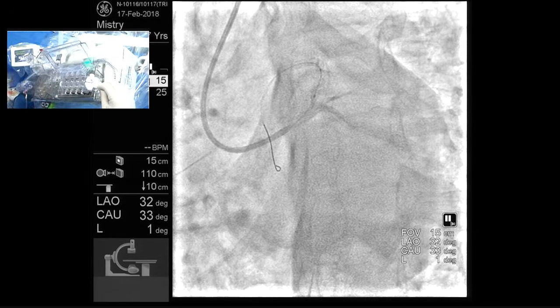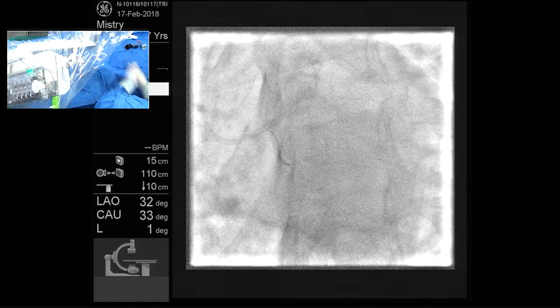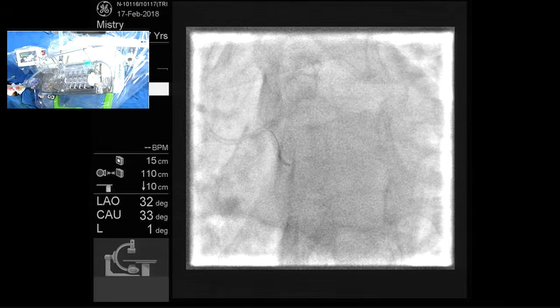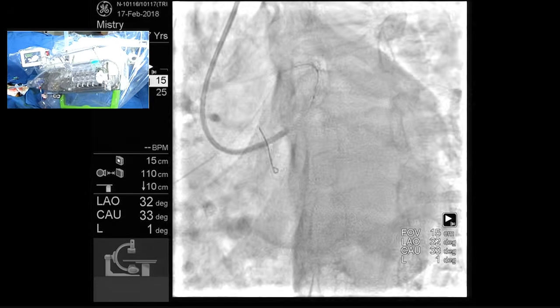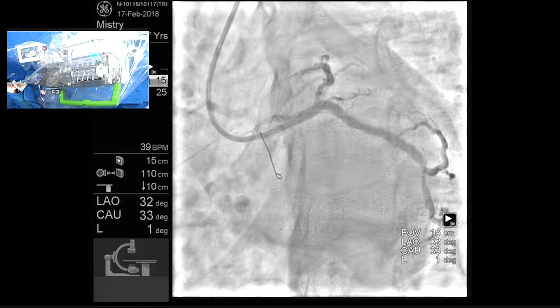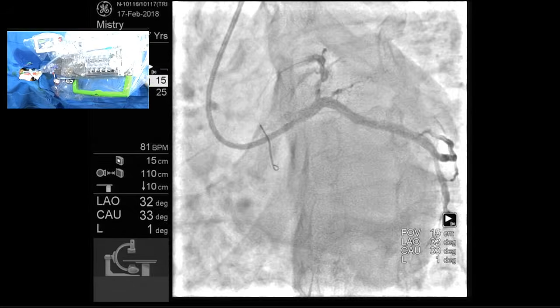It would have been easier if you'd have played with some Nintendo in high school also. 34. Will it be a little longer? Yes, it will be longer. I think 30 is quite okay, and the left main is capacious, so there is a big size angle between the left main and the LAD and circ, but it won't be a problem. So yeah, it is still okay.